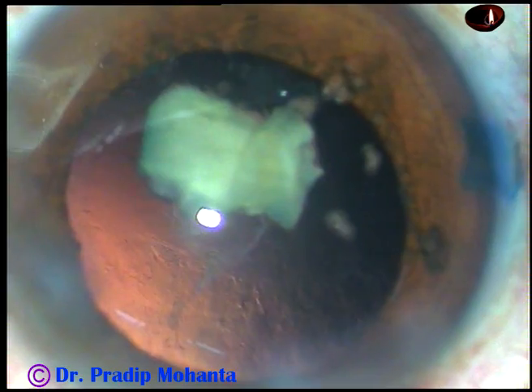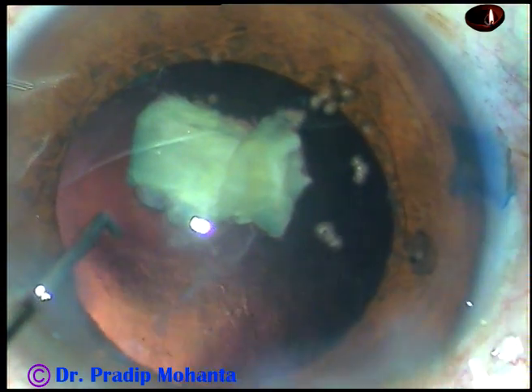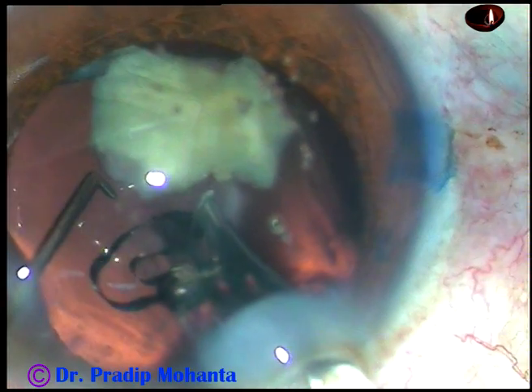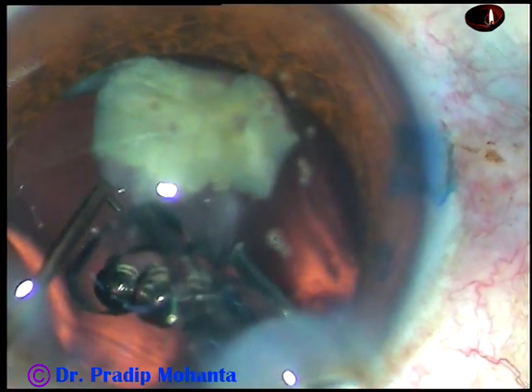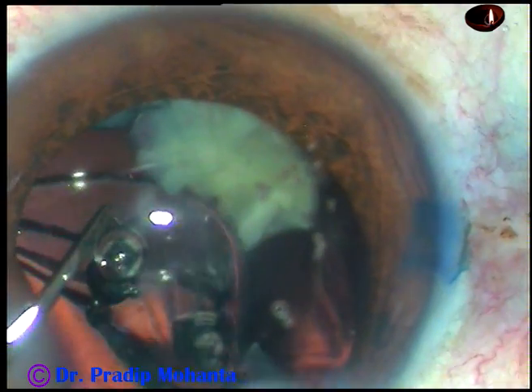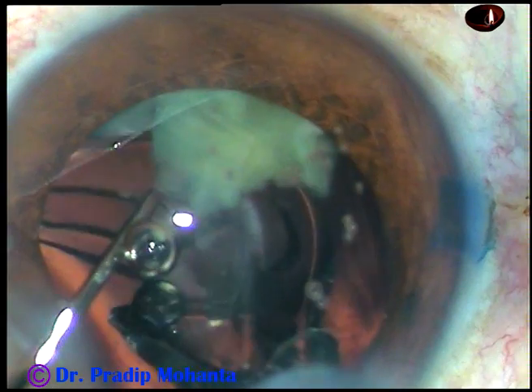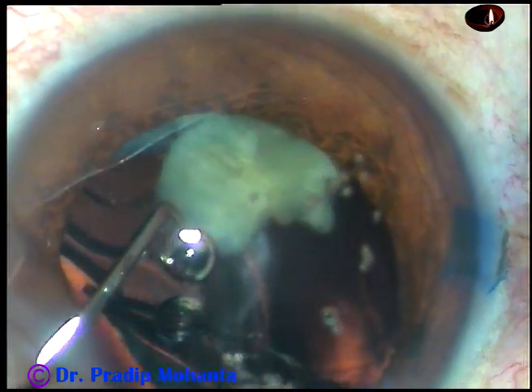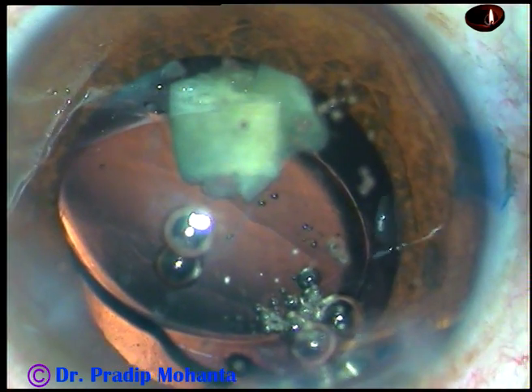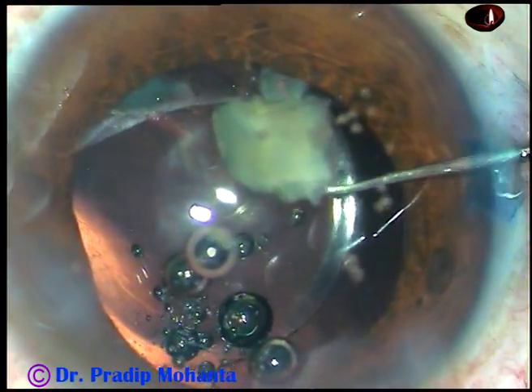At this time we can see only this piece; later we will see another piece hidden at 5 o'clock. Now, here goes the intraocular lens — this is a hydrophilic, acrylic, single-piece, monofocal intraocular lens. The lens goes behind the nuclear piece into the capsular bag. The leading haptic has gone into the capsular bag and the trailing haptic is being dialed into the capsular bag.